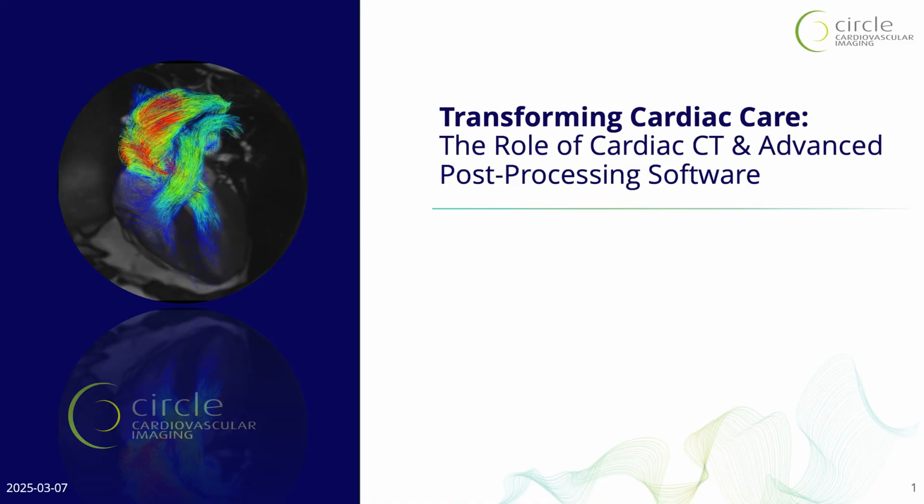exam. This kind of application, or cardiovascular imaging, is transforming cardiac care. They also see value in this space where cardiac imaging, with the changing guidelines, is becoming a frontline test, or the first test, for cardiovascular disease, but that its application is moving out of the cardiology specialist area and into primary care.